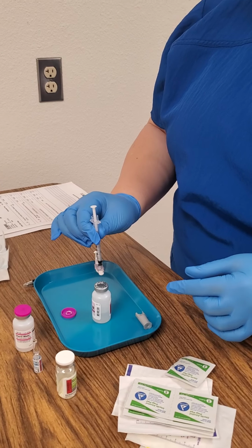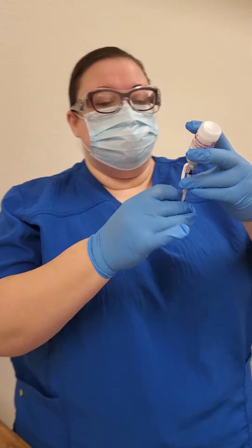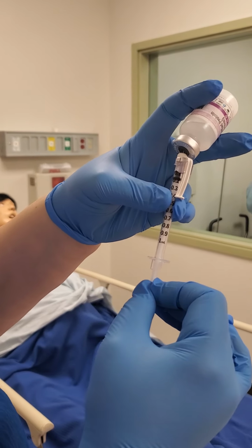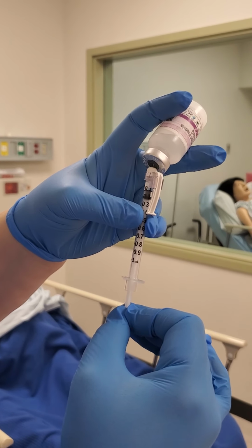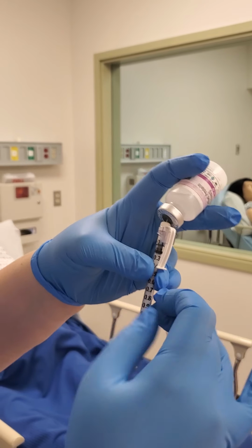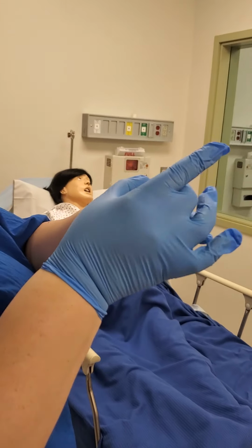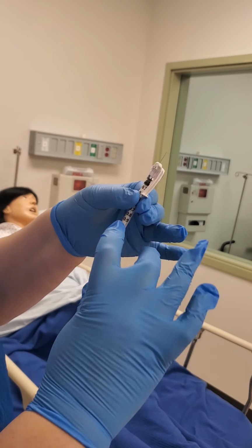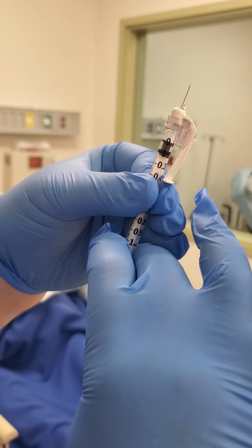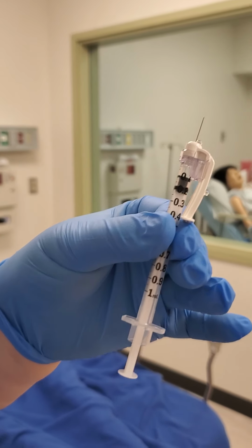And then put my air in here, and then I'm going to turn it up. I'm going to go a little past the 0.1 just so I can get the air bubbles out, if I have any air in it. Okay, I got my air bubbles out, and I got my 0.1.